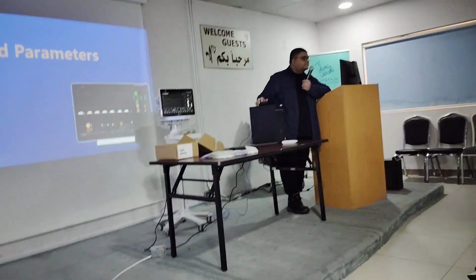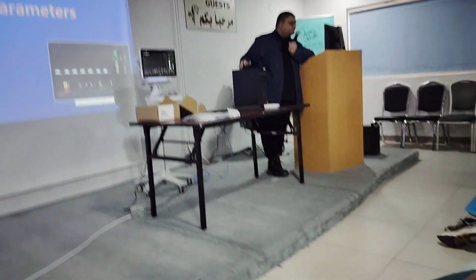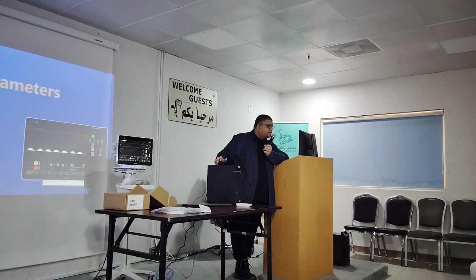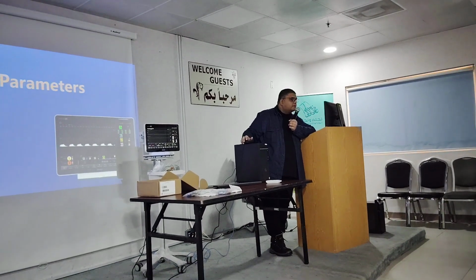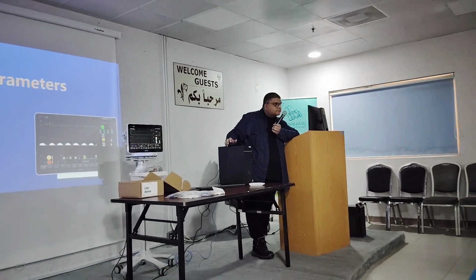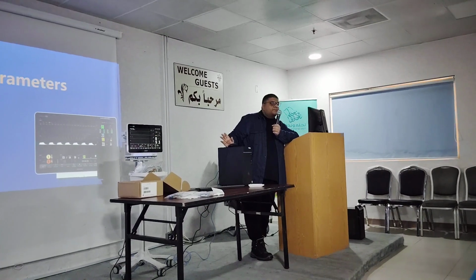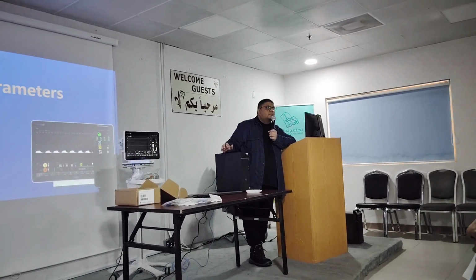Male surgical, because you have too much problem with this one. BP, but I mean, BP is not reading, is not coming to the central monitor. Always the screen monitor is lost automatically during connection to the patient. What is that? In the monitor there is a BP reading, but it is not coming to the central monitor. Oh, it's not displaying on the monitor. No, they are displaying in the monitor, but you should click the bedside. The bedside, it will show you the monitor.